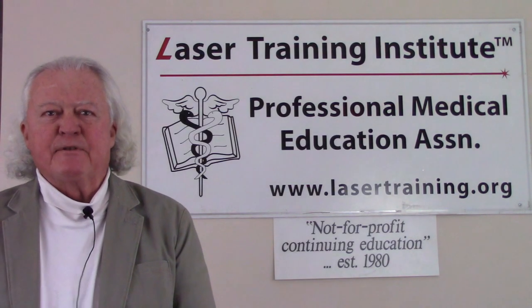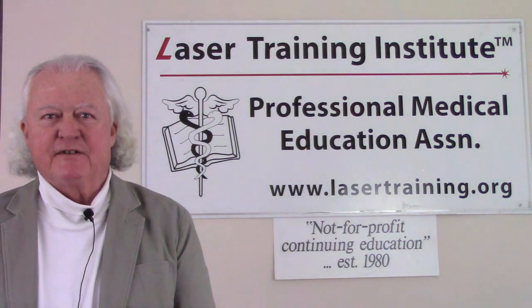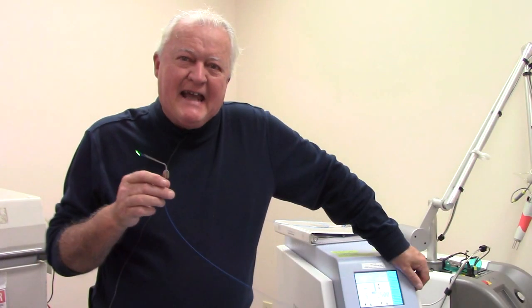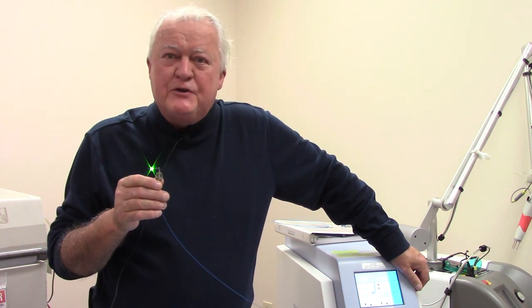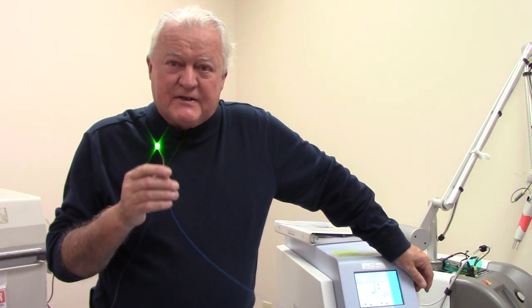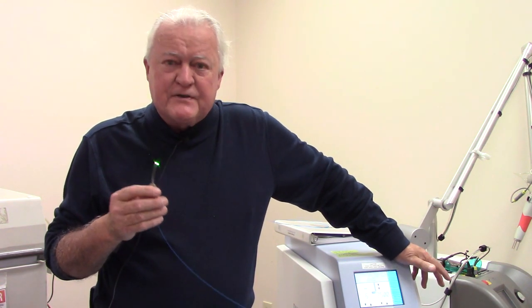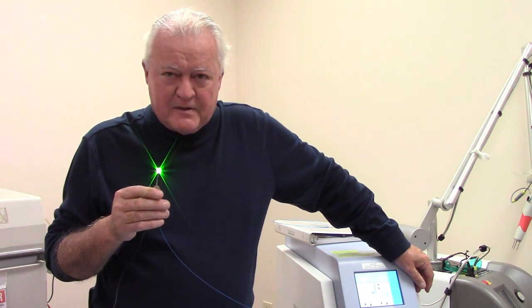Hi, this is Greg Abston from the Laser Training Institute of Professional Medical Education Association. Welcome to our short video series on medical laser training. In today's inanimate laser lab, we're going to take a look at some of the tissue effects of the holmium YAG laser, a pulsed laser. These are some of the exercises that we might have residents do in their medical training to learn the general effects of the lasers and the fibers at high and low energy settings.